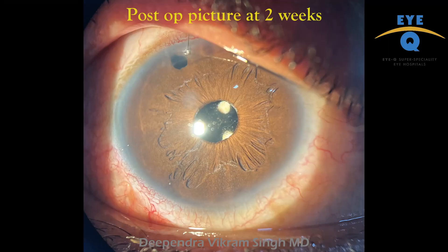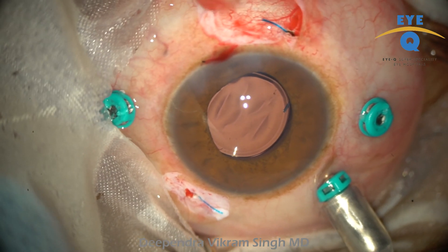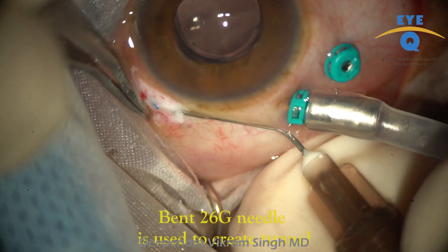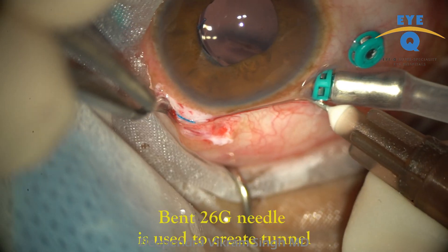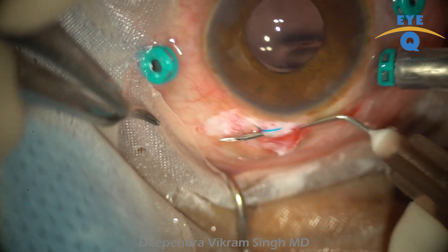A well-centered IOL can be seen at two weeks post-operative follow-up. The same patient's fellow eye was also operated using a similar technique. Pars plana lensectomy was followed by IOL injection and exteriorization of both haptics.